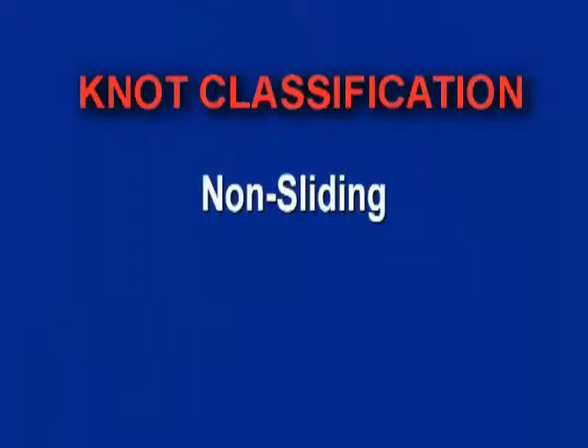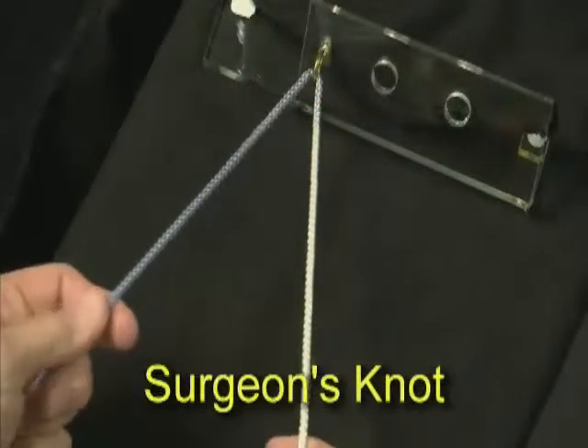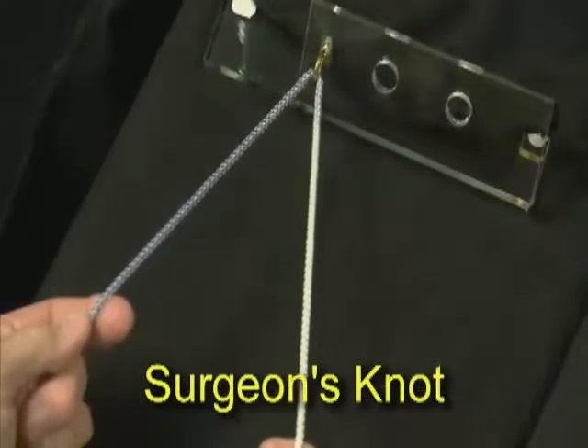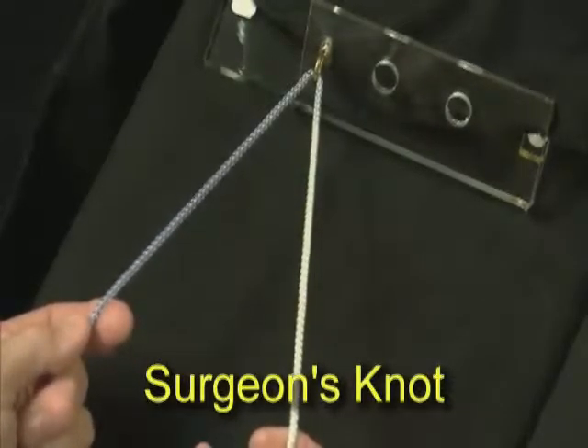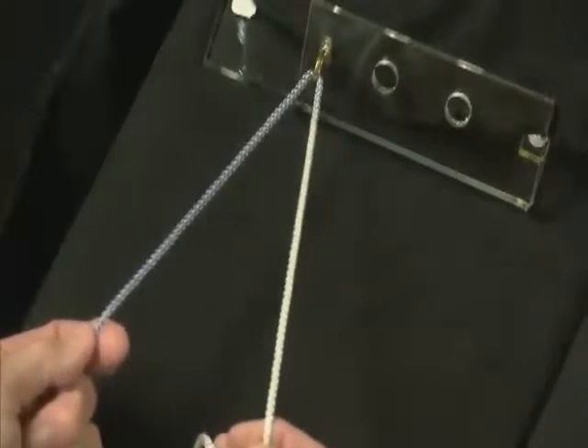Knots can be classified as non-sliding or sliding knots. Dr. Ireland demonstrates the non-sliding types, beginning with the surgeon's knot and half hitches. A surgeon's knot has basically three underpasses on your base knot, and then three reverse half hitches alternating posts.